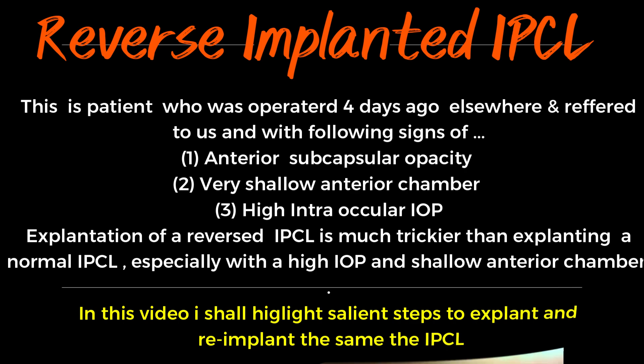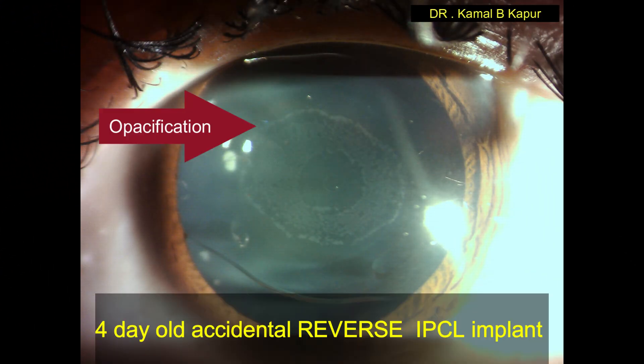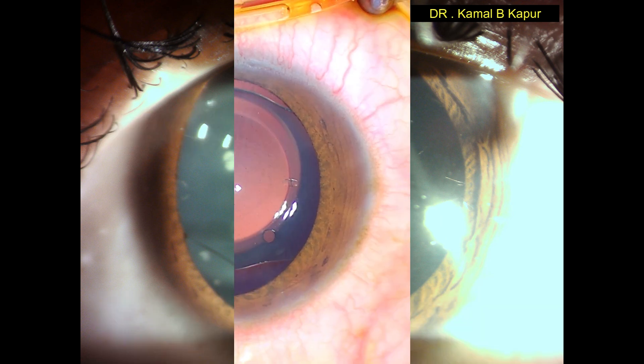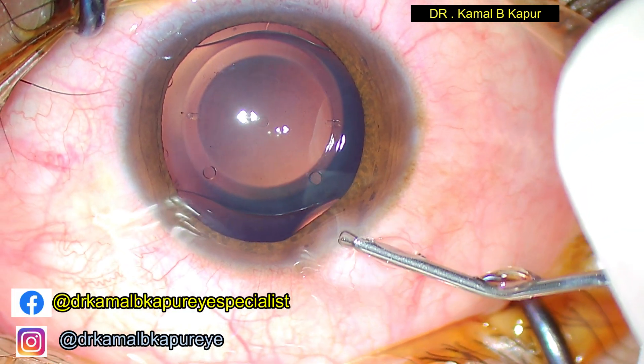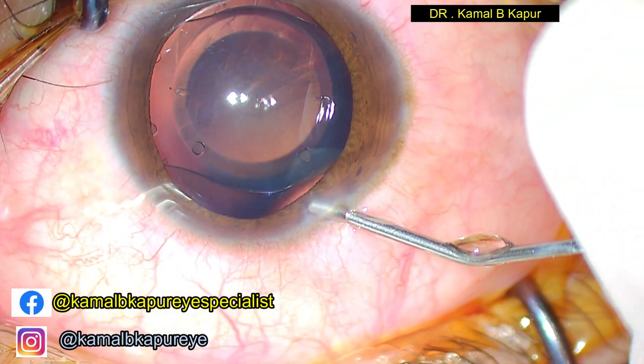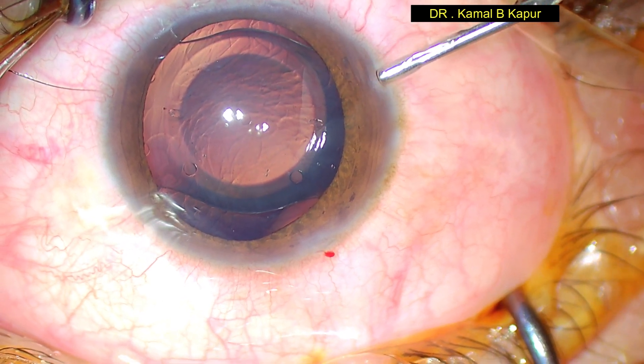This explantation can be very tricky compared to an explantation of a normal lens. As you will notice, there is a peripheral ring on the subcapsular cataract which has already started appearing within the first four days. Since the incisions are not very old, we will proceed to open the original incisions and proceed with the surgery.